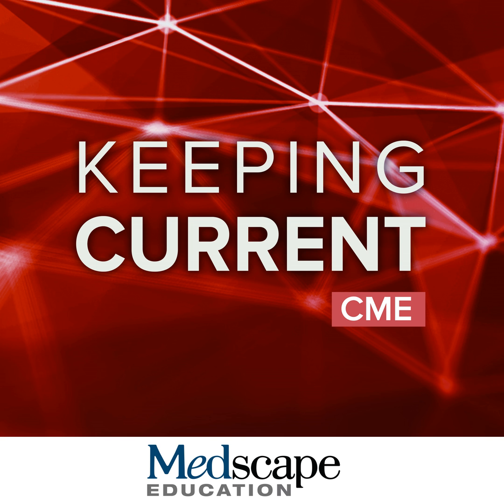Similarly, for the T2 FLAIR, a standardized imaging approach is needed to avoid ARIA-E mimics. So this is a case of a patient who had their baseline MRI performed on vendor A. When they presented for their 3-month post-dosing exam, it was performed on vendor B. We see apparent increased extent of T2 hyperintense signal in the occipital white matter, a common place for ARIA. So this was called possible ARIA-E, and the patient returned the next month for repeat imaging. We see over the course of serial exams that the difference in the appearance of the occipital white matter was due to changes in the scan vendor rather than the presence of ARIA.